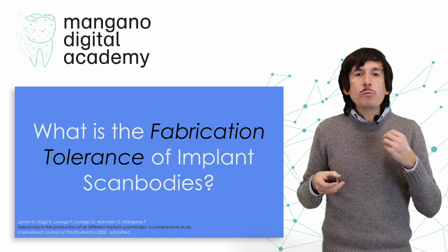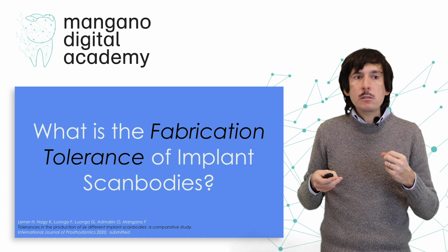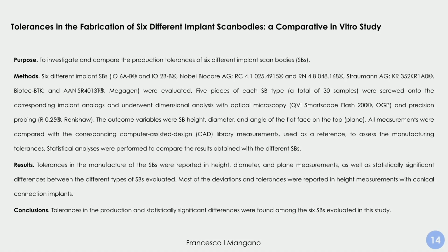So we wanted to investigate, as a research group, what is the fabrication tolerance of implant scan bodies. We investigated it in this study that we have recently submitted to the International Journal of Prosthodontics, together with Dr. Henriette Lerner, Dr. Fabrizia Luongo, and Dr. Giuseppe Luongo. We compared 6 different scan bodies that are commercially available on the market. We investigated them with an optical microscope and then through precision probing, and we compared the results of each single specimen with the reference file.